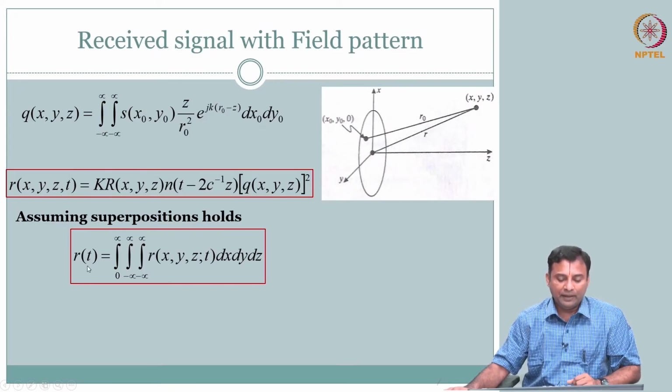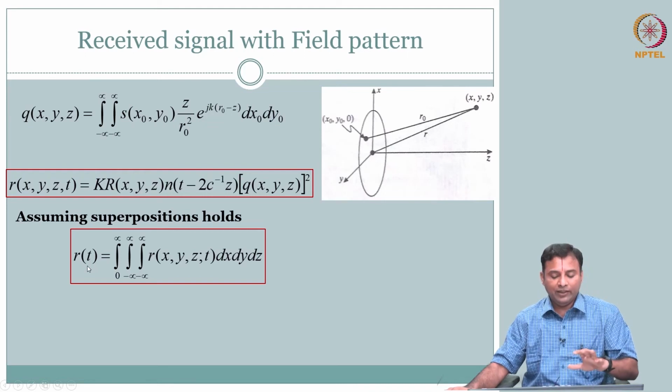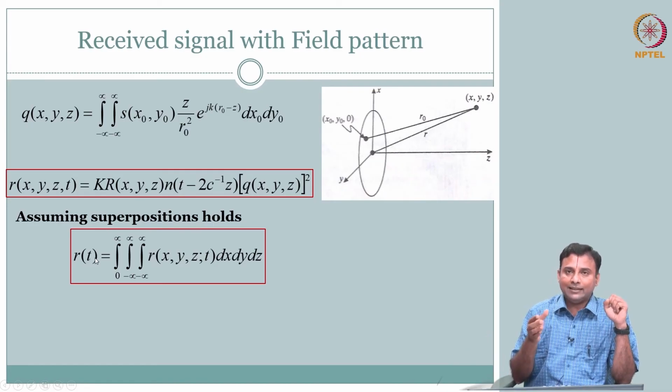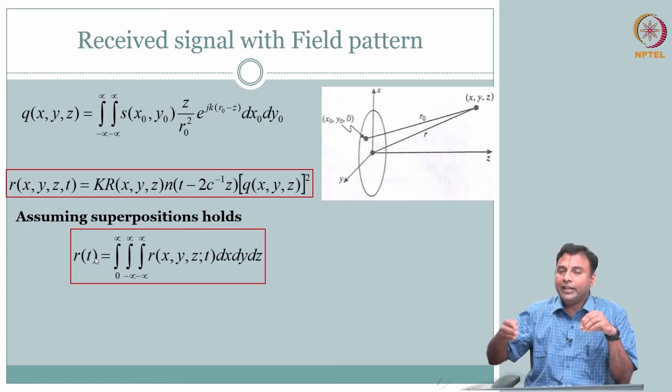So, this is fine, and it is intuitively easy to address, but then you have several different terms. So, we need to figure out, if you say that R of t is this, then t, as you can notice, even though it says t axis, what is it saying? Oh, it is going deeper in the tissue.